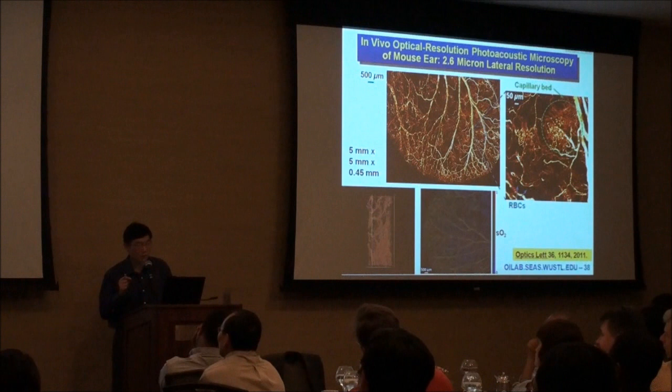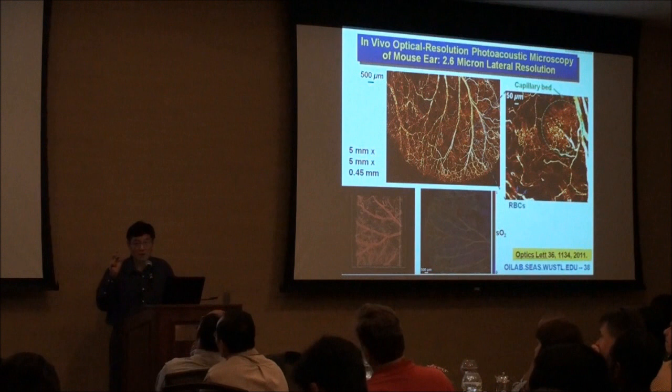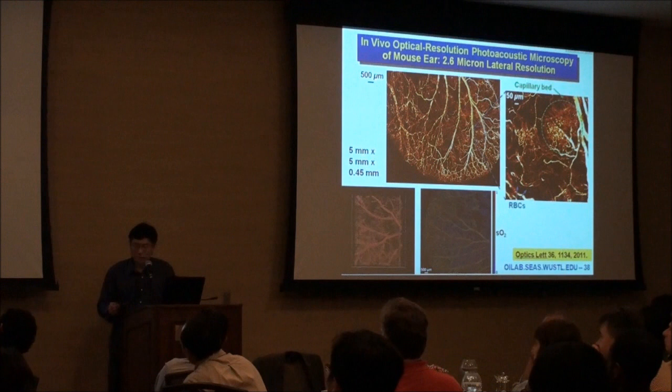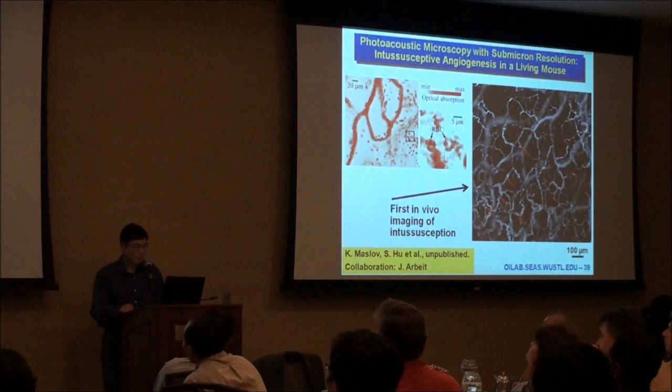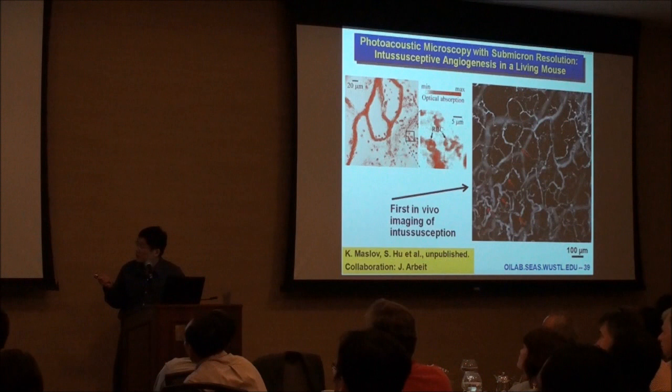So we're essentially doing single blood vessel oximetry. You might have heard of pulse oximetry, which is very widely used in the OR or in the hospital in general. Right, so that really volume averages and doesn't really measure vein oxygen saturation, only measures arterial saturation, requires pulses. So this is single vessel oxygen saturation. We improved the resolution to about 0.9 microns. And at this resolution, you can see single red blood cells. You can see the donut shape in the single red blood cells.